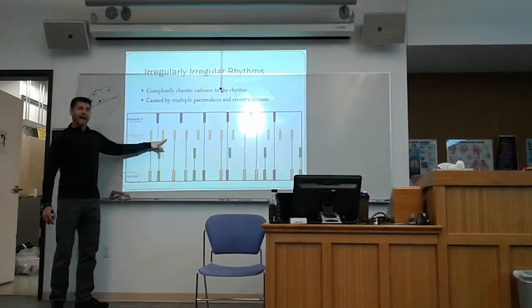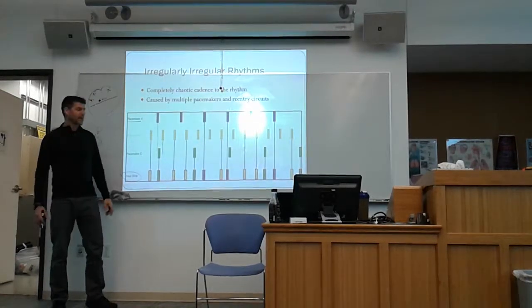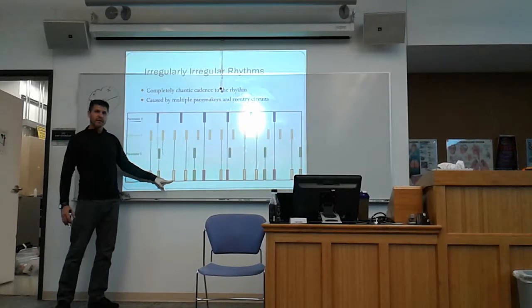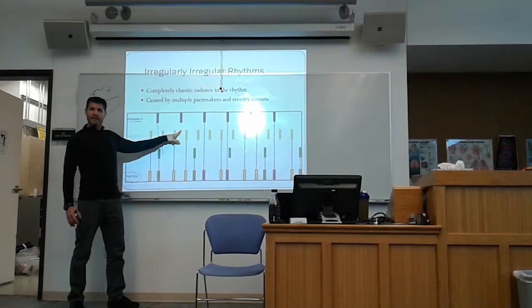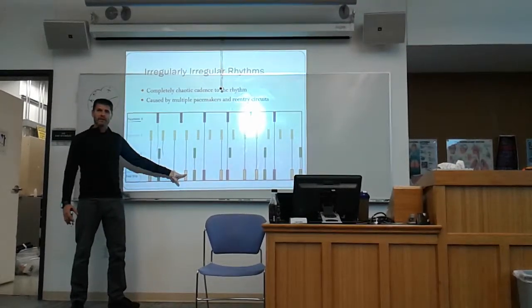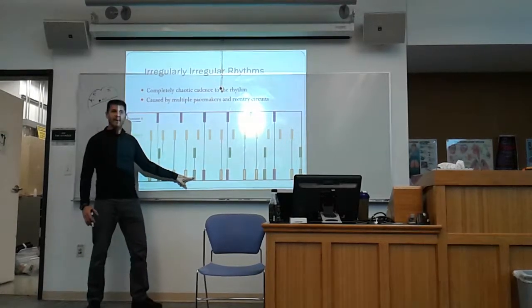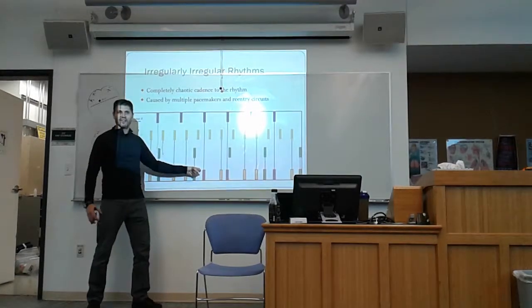B was going so fast, though, that it sent a signal before blue or green ever sent another signal. So the AV node was reset and was able to listen to that signal. After it listened to that signal, blue had sent its signal, but it was refractory again, so it didn't pay attention to it. It couldn't respond to it. By that time, yellow had already sent another signal, and it could. It went through its refractory by the time the green got sent again, so it paid attention to the green, and now was refractory to the next yellow signal.